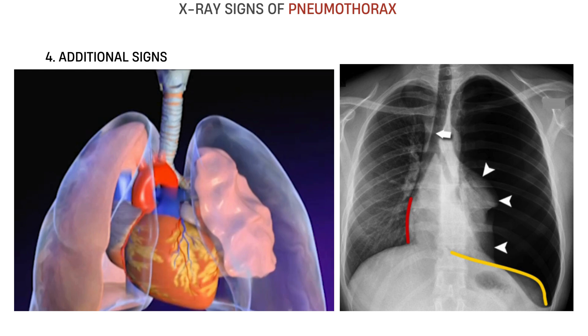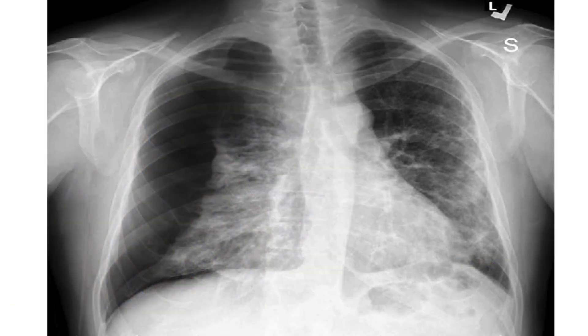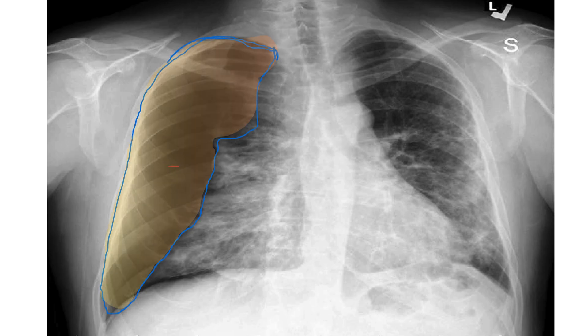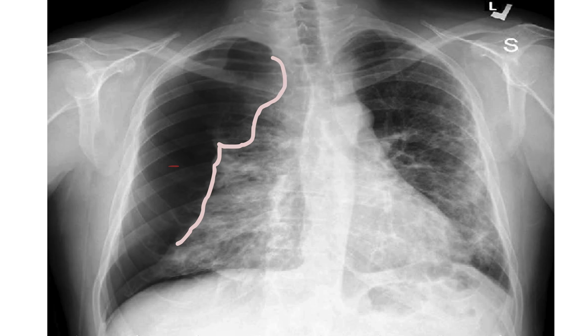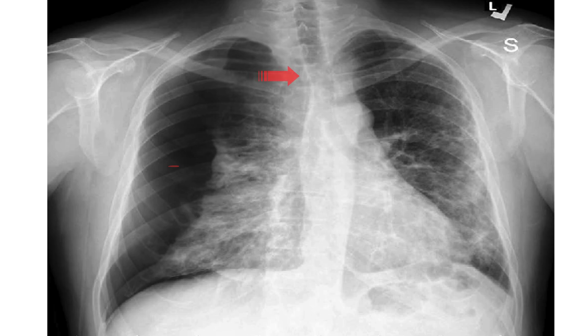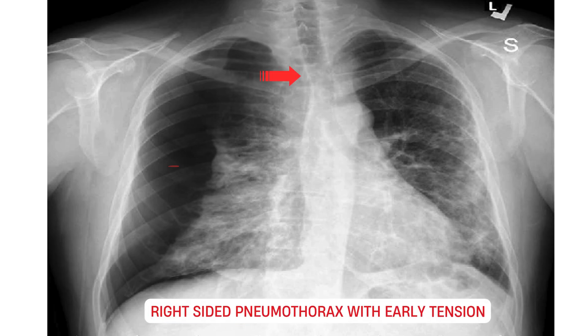Let's apply what we just learned to a real case. Look at the right lung field: no lung markings in the upper lateral zone, a visible pleural line — this is the collapsed lung edge — air beyond the line, completely black, and slight mediastinal shift to the left. Diagnosis: right-sided pneumothorax with early tension features.